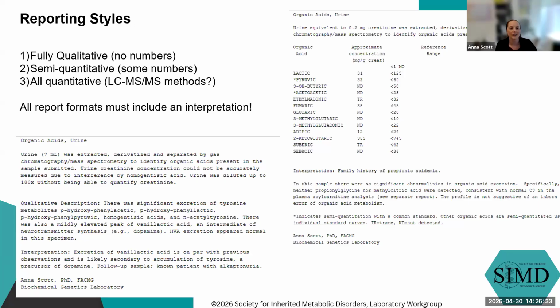This is not like your drug monitoring labs where you've got high accuracy quantitation of that compound in your fluid of choice. This is fuzzier because urine is fuzzy. It varies in concentration, it varies in interference. We do not have heavy isotope internal standards for every single metabolite that we might be able to detect. They're not commercially available, and it would also be an insane amount of work that most of the time doesn't matter.